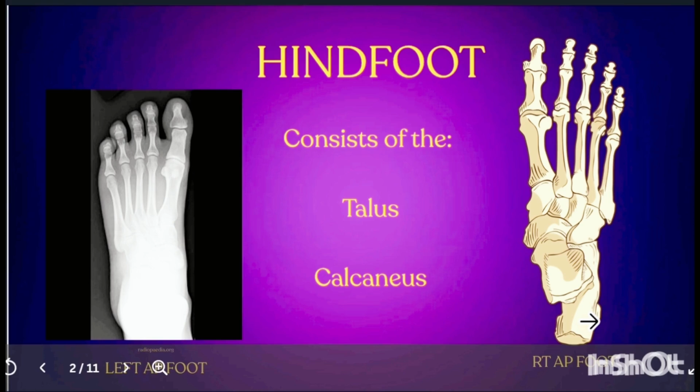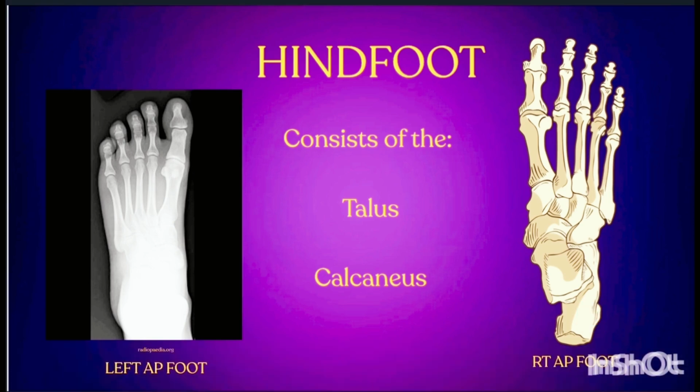When you look at it on a foot radiograph, make sure that you pay attention to the subtalar joint. This allows for the inversion and eversion movements of the ankle. And then again, the alignment of the second metatarsal with the intermediate cuneiform. This is a common area for a Lisfranc joint complex, and I will go into detail on that in an upcoming slide. Make sure you know the sustentaculum tali, and that you can also see the longitudinal arch of the foot. So again, the hindfoot is the back part of the foot, which makes up the talus and the calcaneus. If you don't understand these relationships anatomically, you won't recognize the pathology radiographically.